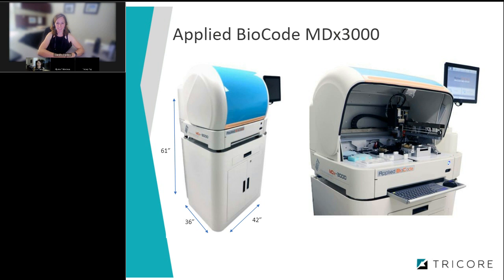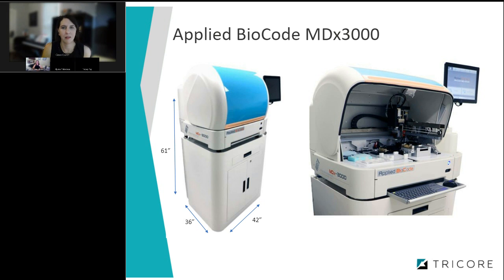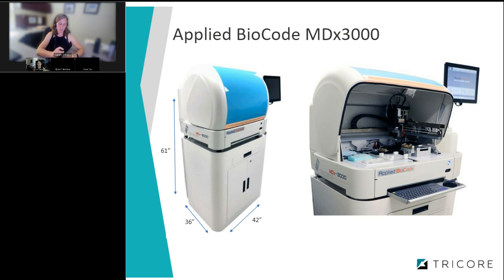What do you use for dilution? So it's diluted into star buffer, and I believe it's 50 microliters from the star aliquot that gets added to 150 microliters of star buffer plus internal control.